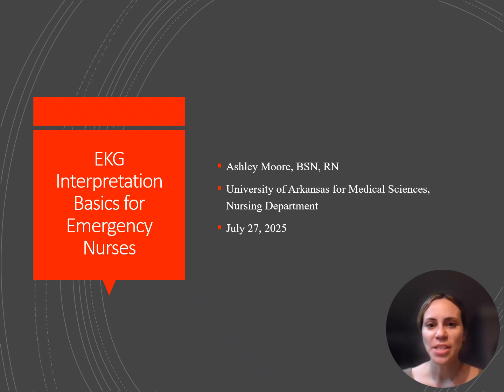This presentation is designed for novice to intermediate emergency department nurses who are looking to strengthen their confidence and accuracy in reading cardiac rhythms. Over the next 30 minutes, we'll walk through the components of an EKG waveform, learn how to calculate heart rate, differentiate between normal and life-threatening rhythms, and explore appropriate nursing interventions guided by ACLS protocols.